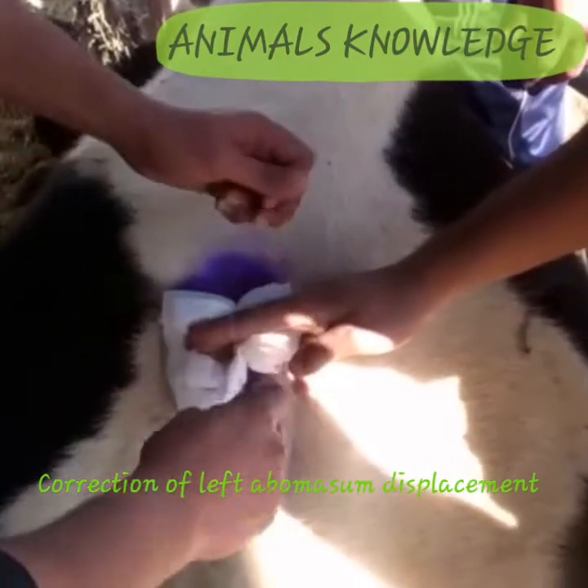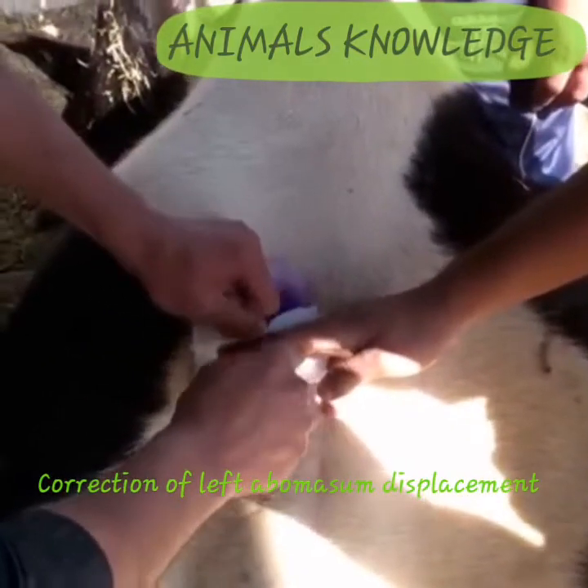Put three fingers and then tie both sutures together.